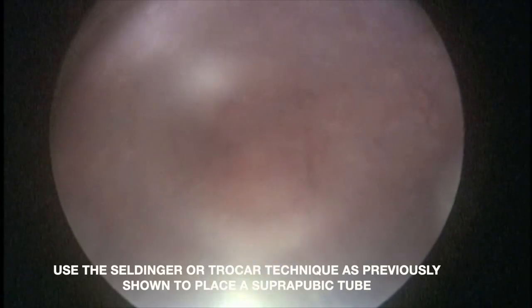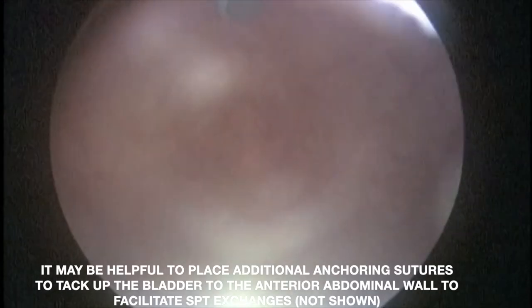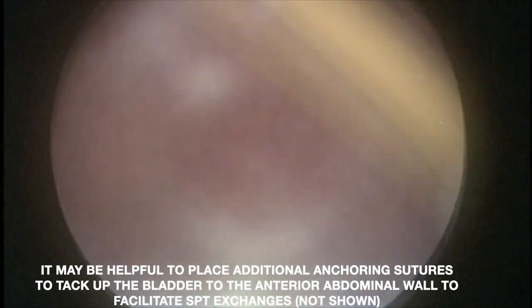Once you are confident that the tract has been obtained, use the Seldinger or trocar technique as previously discussed and place the suprapubic tube. Although not shown, it may be helpful to place additional anchoring sutures to tack up the bladder to the anterior abdominal wall to provide extra support.